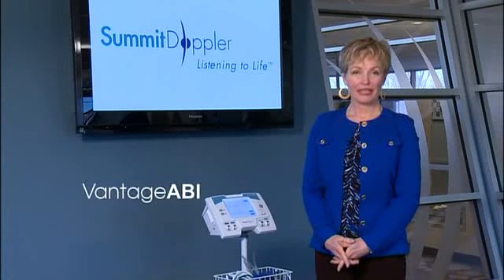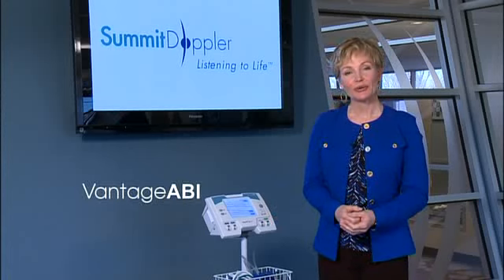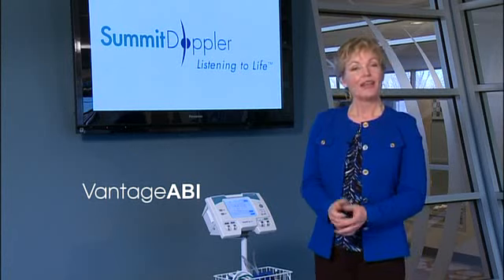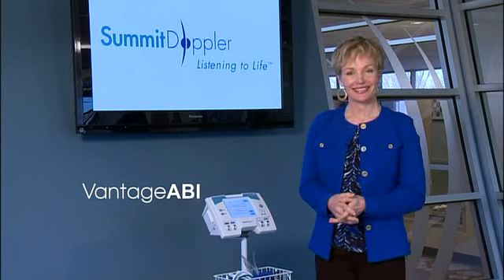This video will provide detailed instructions for using the Vantage ABI to diagnose peripheral arterial disease, also known as PAD. The ankle brachial index, or ABI exam, will be demonstrated. PAD is a common manifestation of atherosclerosis. Per the American Diabetes Association, it affects 8 to 12 million people in the U.S.